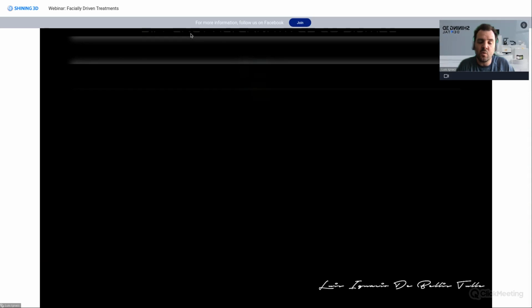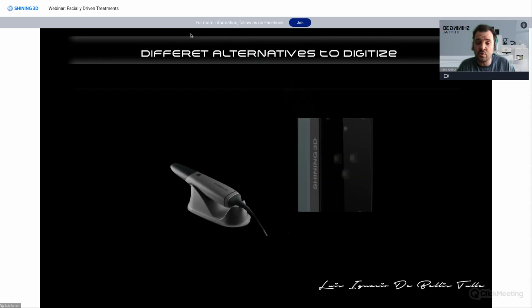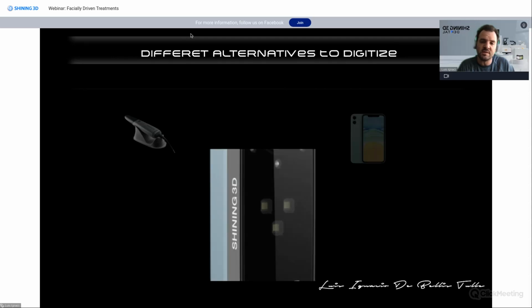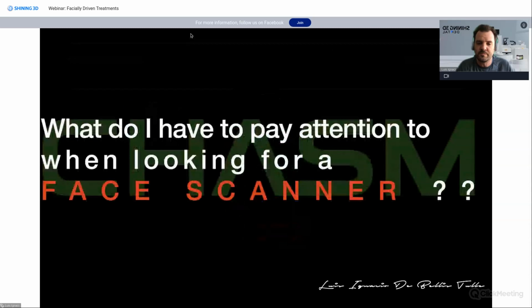And the last way of making facial scanning, that obviously is more expensive and not everyone has, is with your CBCT. For example, Planmeca and Carestream have released in the last year a CBCT that takes a facial scan while making the CBCT of the patient. So you can get the face of the patient matched at the same time that you're getting the DICOM file, in case you need that for some surgery purpose.